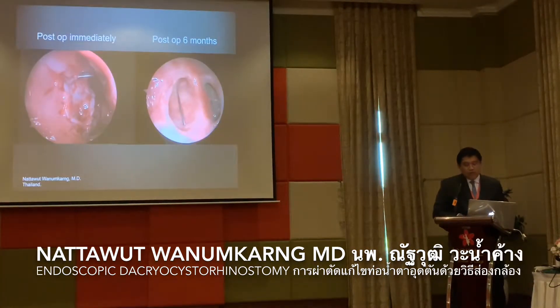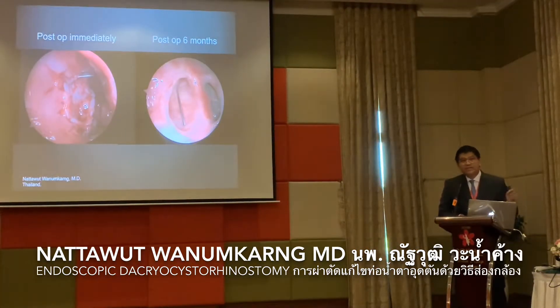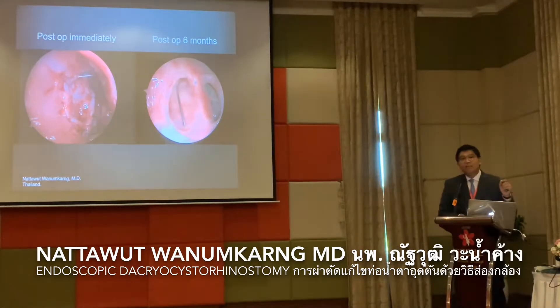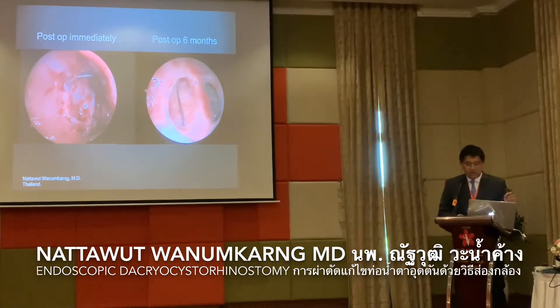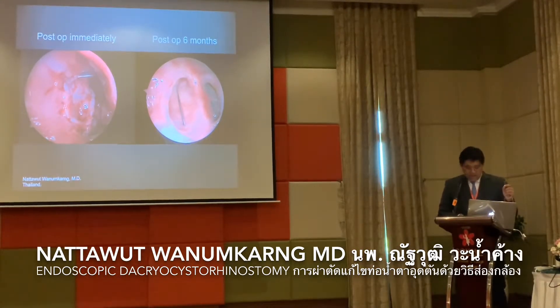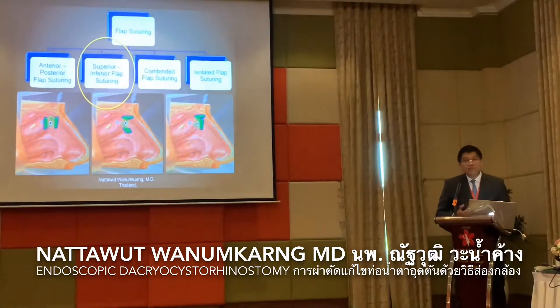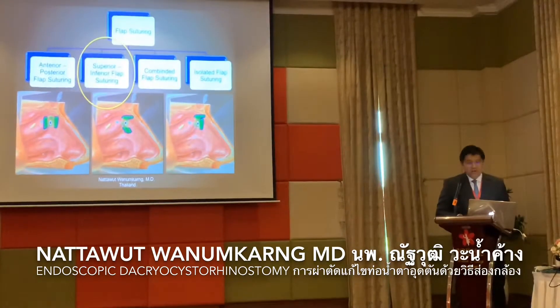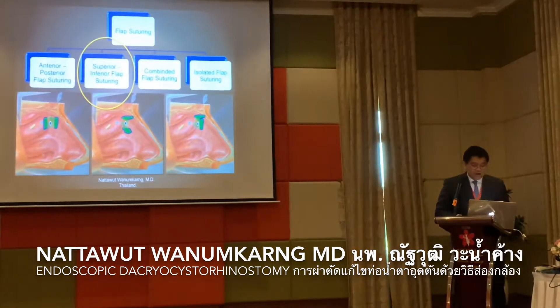This shows before and after the healing. You can see the healing of the nasal ostium is very good and wide. Sometimes people who know the nose can feel the air pressure from the nose to the eye.